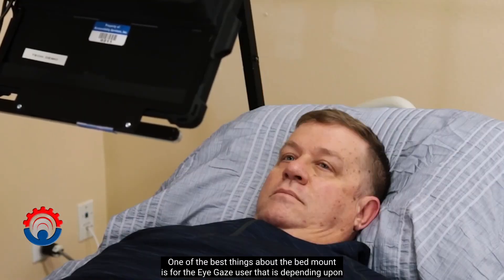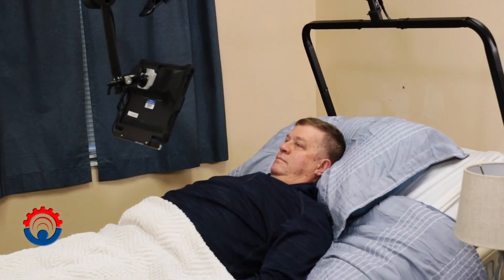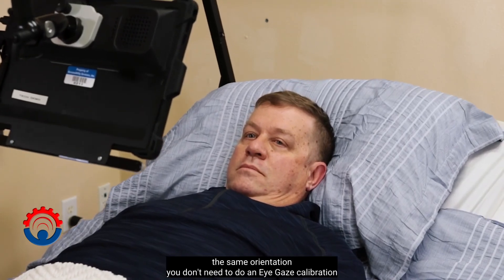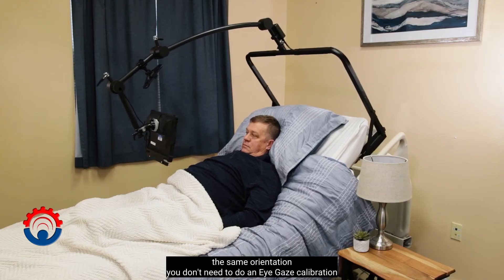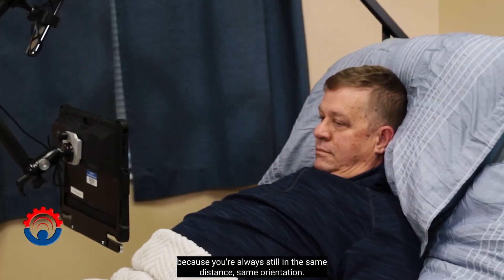One of the best things about the bed mount is for the eye gaze user who depends upon their orientation to the tablet. With the bed mount maintaining the same orientation, you don't need to do an eye gaze calibration because you're always at the same distance and same orientation.